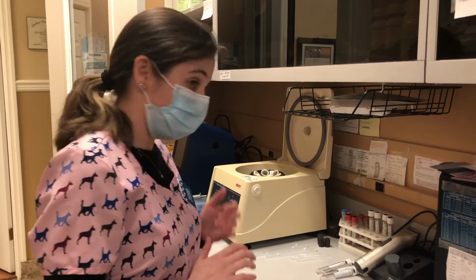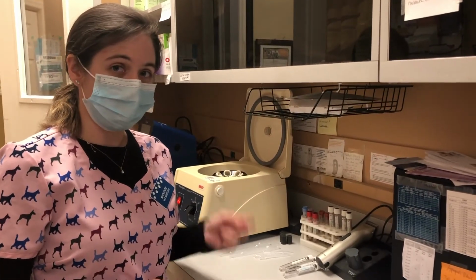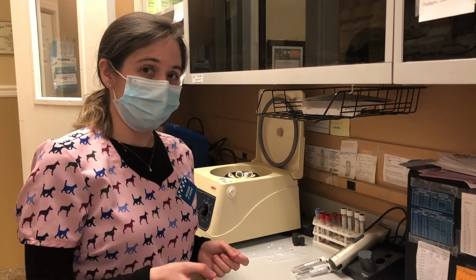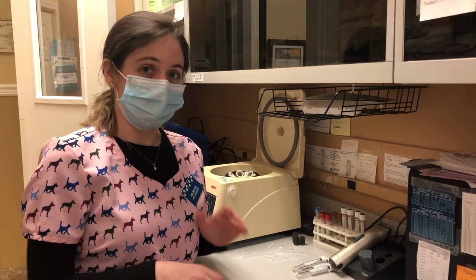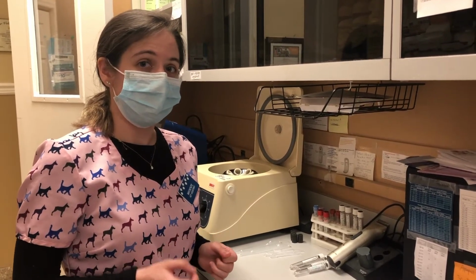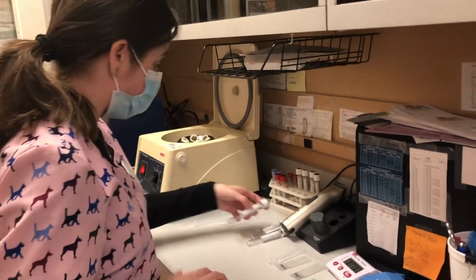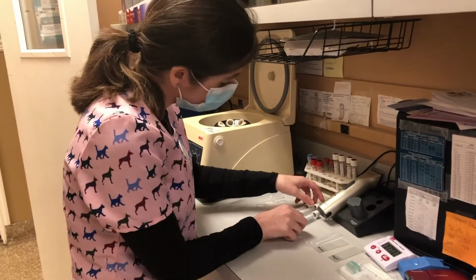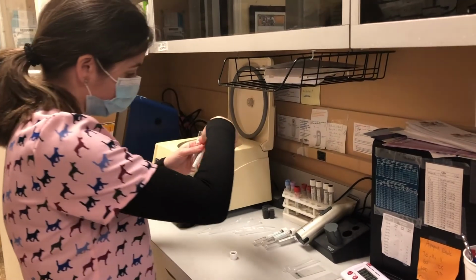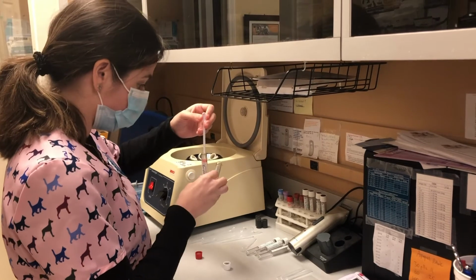So I'm going to take 2 drops of my recipient serum and 2 drops of my donor cell suspension, and that's going to be my major. Then 2 drops of my donor serum and 2 drops of my recipient cell suspension, and that's going to be my minor. So I have new tubes. I have my major, and I'm going to take 2 drops of my recipient serum and put that in there.